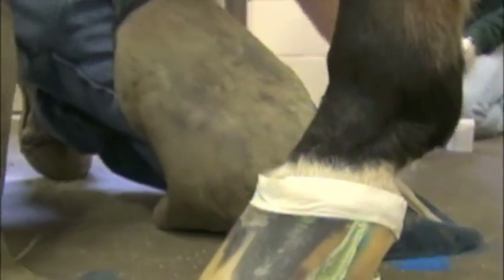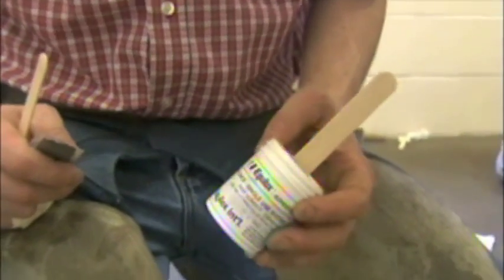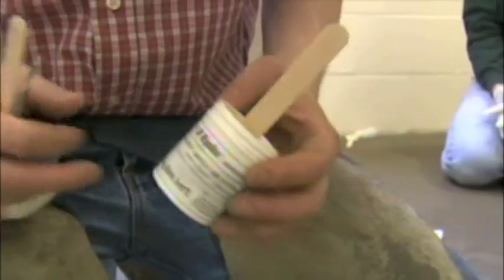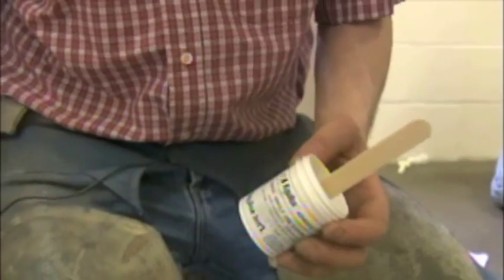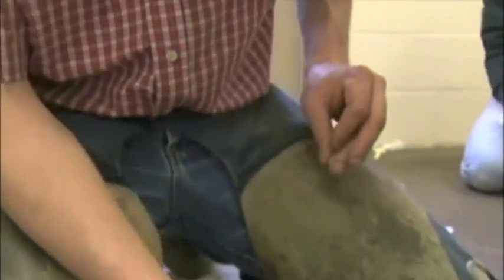A two-ounce jar of Equilox — just two ounces is usually all you need. For smaller cracks or smaller feet, you can probably get by with one ounce and maybe just two strips. This is a pretty big horse, so we're going to use three strips and two ounces.